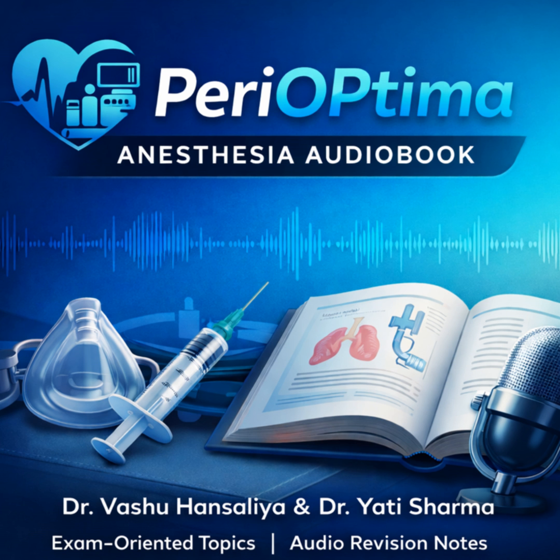Okay. Oxygenation is dependent on the blood flow rate. The more liters per minute of blood you push through the oxygenator, the more hemoglobin you expose to oxygen, and the higher the patient's PO2 will be. So if my patient is hypoxic on ECMO, I increase the flow. You turn up the RPMs on the pump to increase the flow.